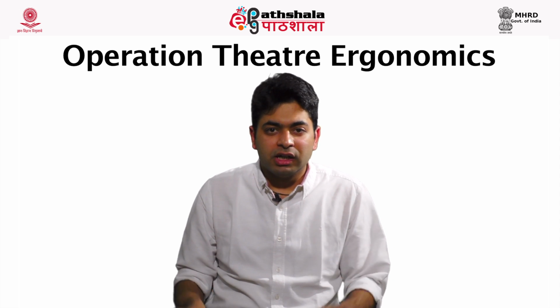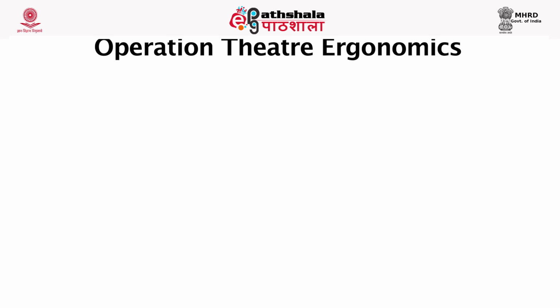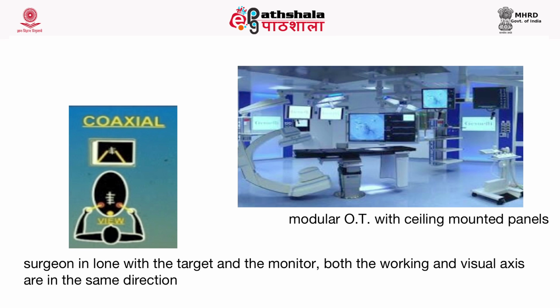Now the first thing in ergonomics that we should do to get a better coordination between the surgeon and the operation theatre is, we will start with operation theatre ergonomics. Now the most recent thing that has come into the operation theatre is known as modular OTs. In modular OTs, all these instruments and instrument tables, panels and other things are ceiling mounted, so that they could be moved from one place to the other, the height could be adjusted, more space is available and better cleaning can ensue. There are other factors of modular OTs like laminar flow of air and all the corners are smooth, but in relation to ergonomics, ceiling mounted is one of the most important things.